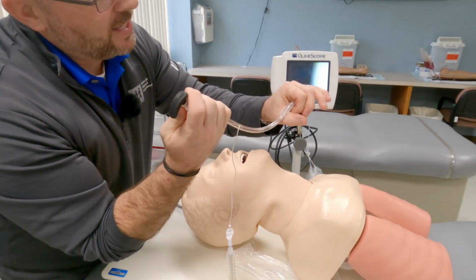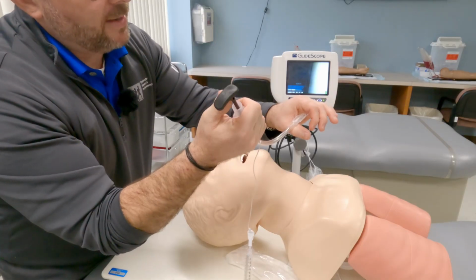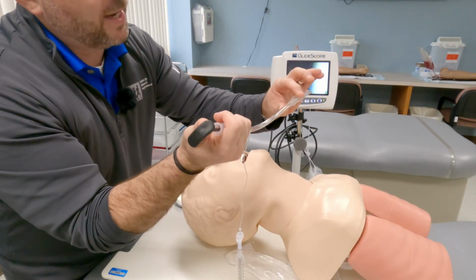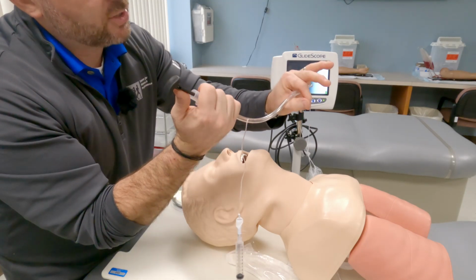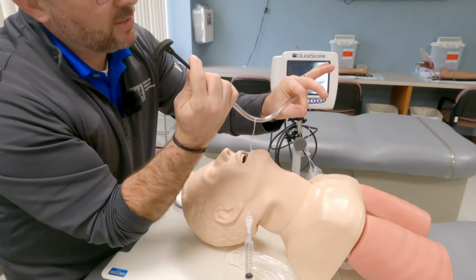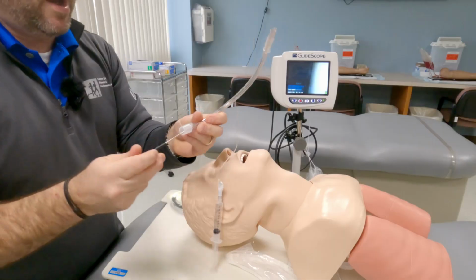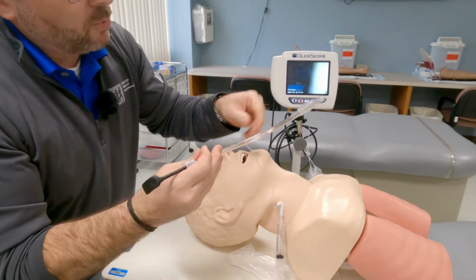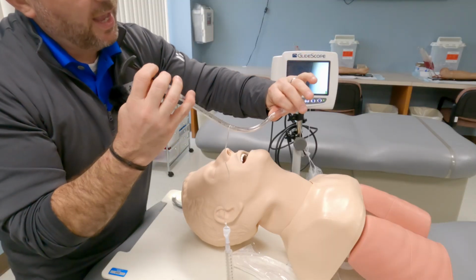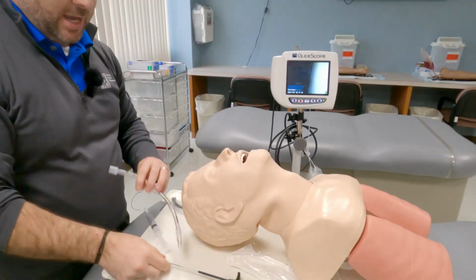But if I go like this and I'm inside the cords and I push this up, popped it up, you can see it makes the end of the tube, especially if it's warm down there, it's going to be able to bend. And so it's going to be able to bend and turn into the trachea. And then I'm going to take it out here. So by popping that up, it gives you more flexibility at the tip so that that can insert in and then you can withdraw. Make sure you withdraw always towards the chest.